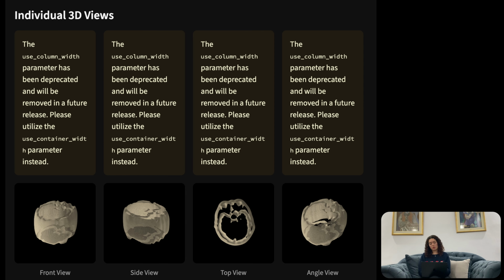In the next phase of this project, my focus is on improving the reliability of the 3D tumor representation. This means refining how the tumor is perceived: the volume, the transparency, the validation, all with some research, and improving the smoothness and shape consistency.